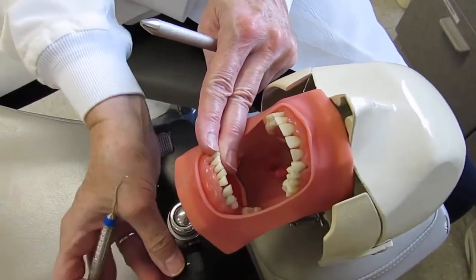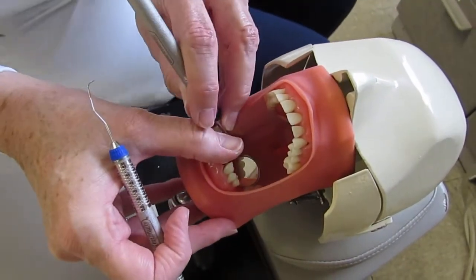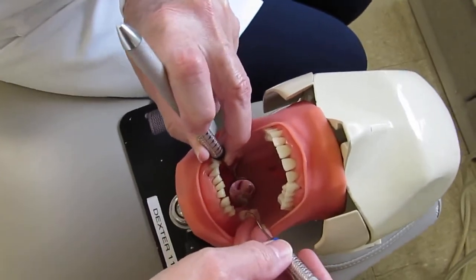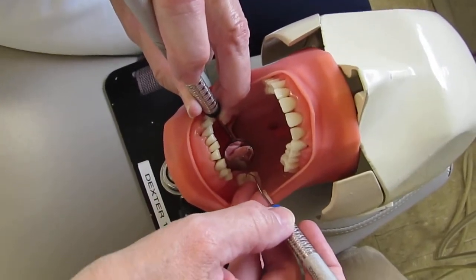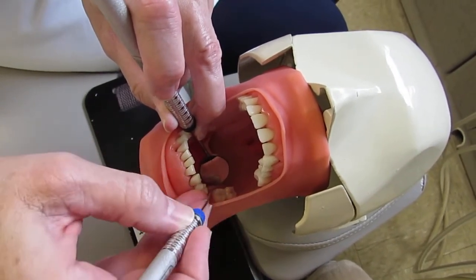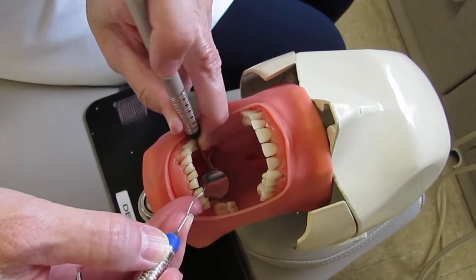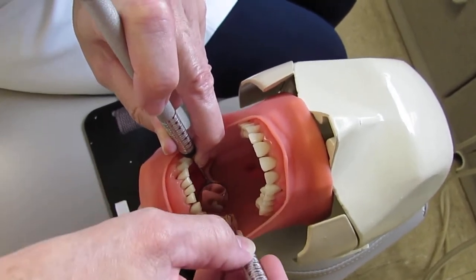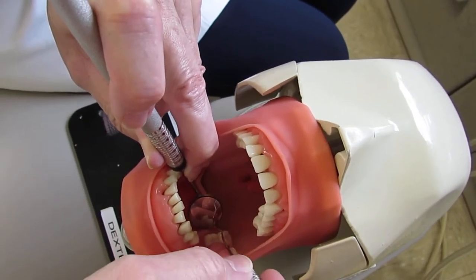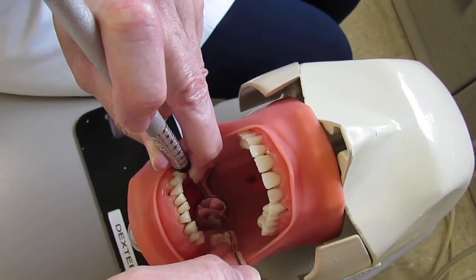When doing it sextant by sextant, eight o'clock clock position works well for the lingual and the tongue side. Fulcrum on the tooth you're working on since we can't reach otherwise with the 11-12 — we need the middle finger on the shank to feel vibrations, which is especially important with this instrument. The fulcrum is on the opposite side, so there's no real risk of being hit by the instrument.